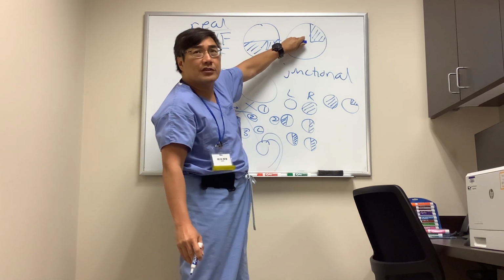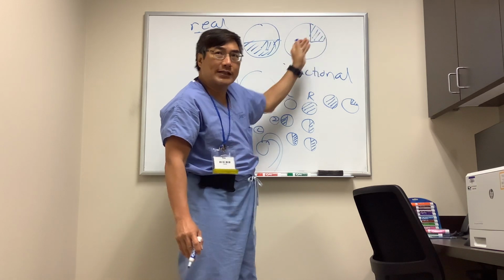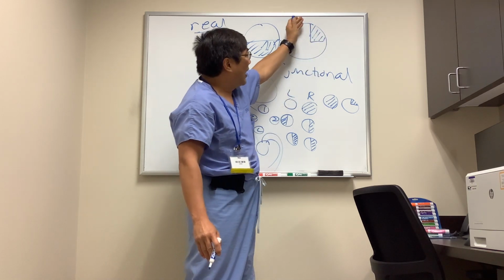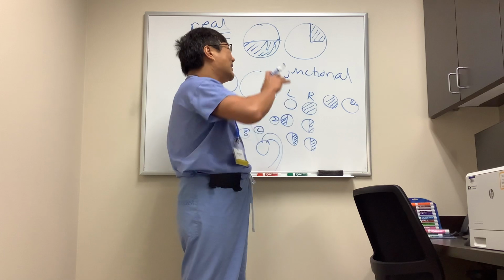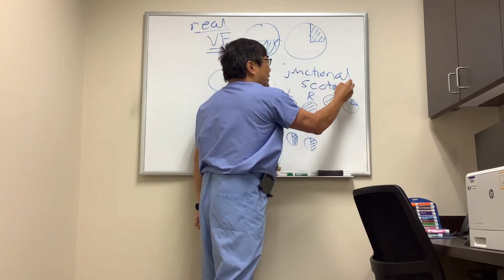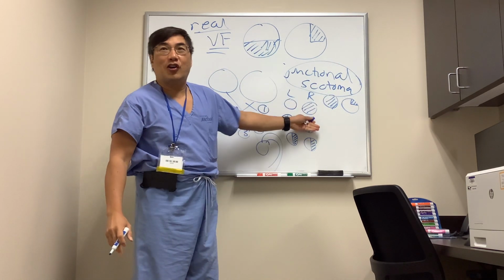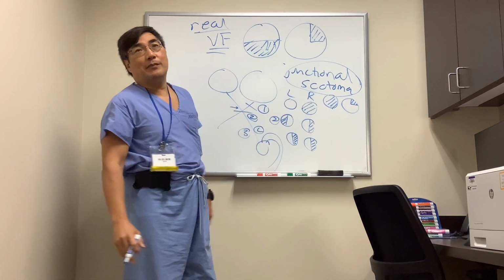This is. So the vertical step and the superior temporal or denser superiorly nature of the hemianopic field in the contralateral eye is the important thing in the junctional scotoma, even if the book doesn't draw it like that, and that is publication bias.